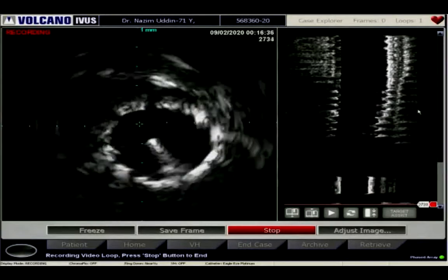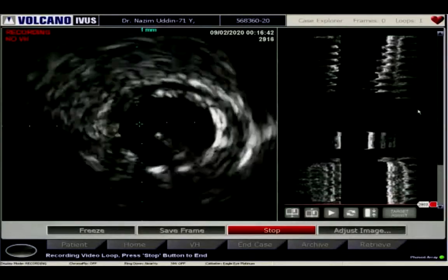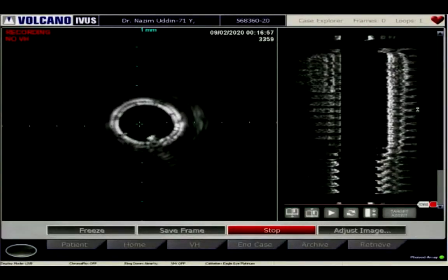Do you want to do the ostia with a 5, or 4.5? No, it's fine, it's apposed, right? Professor Akasaka, what is your comment on the IVUS images? Yeah, just the orifice, I like to do the 4.5. Okay, yes. So we'll get a 4.5 by 8, please. Generally speaking, the IVUS finding is very fine. Well apposed, and I could not identify any significant under-expansion. Very wonderful results.